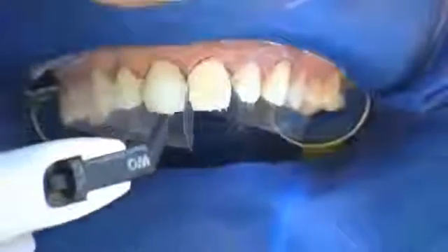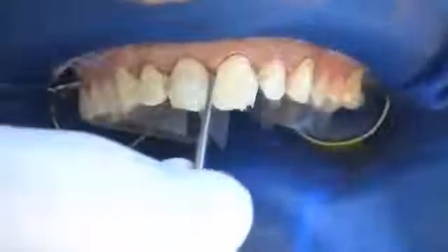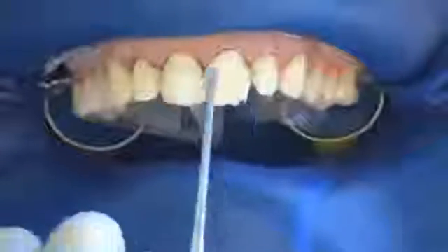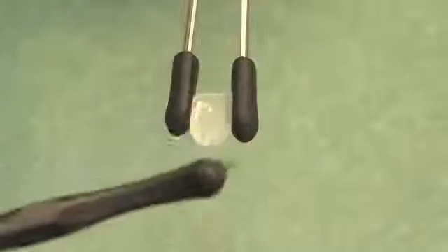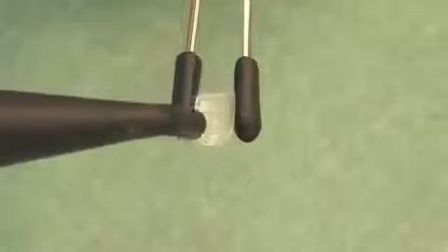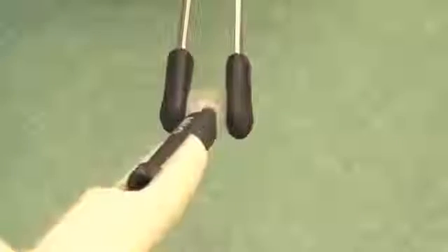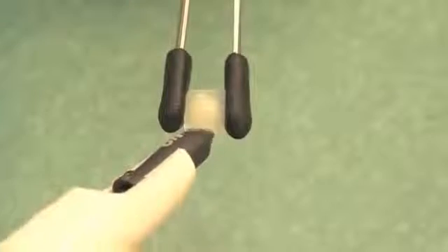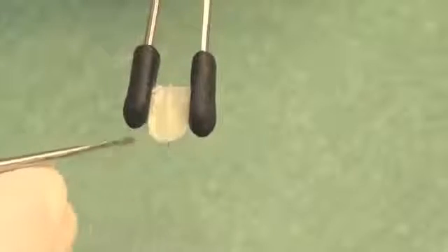At the same time, the COMPONEERs are prepared by the nurse. The COMPONEER holder is suitable for carrying out pre-treatment. If the COMPONEERs have been contaminated, they are cleaned for a short period with phosphoric acid. One coat bond is applied to the inner surface and the margins, blown to a thin layer and not pre-cured. The luting composite is also applied to the COMPONEER in order to avoid air inclusions. Exact marginal adaptation is important.